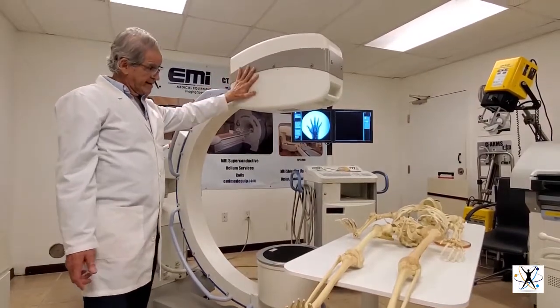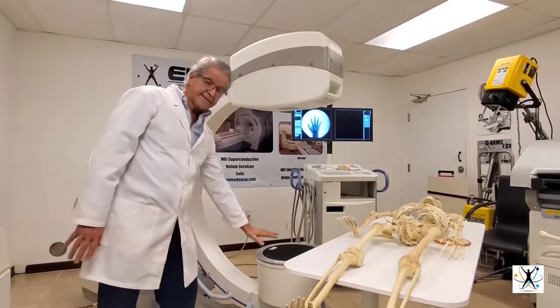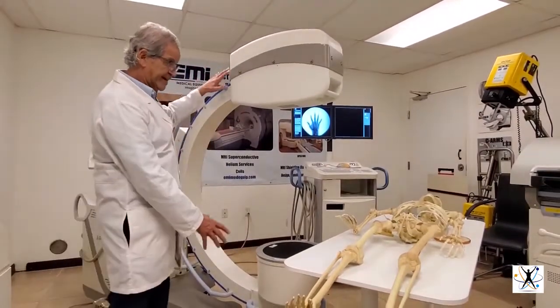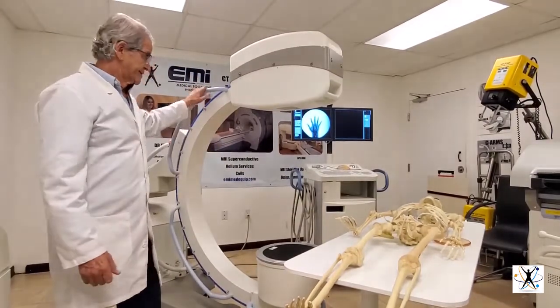We have the X-ray tube that emits the radiation, and this captures the image — it's called the image intensifier. They have different sizes; this is a big one, but there are others with smaller sizes.